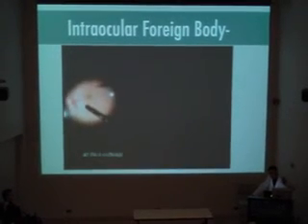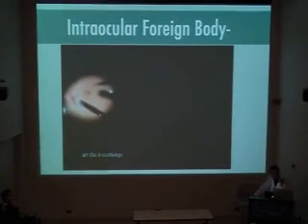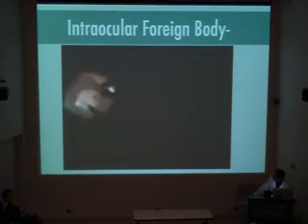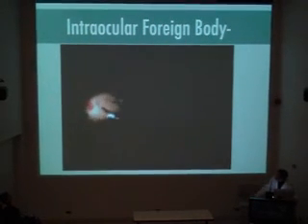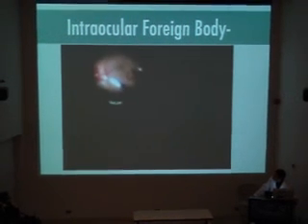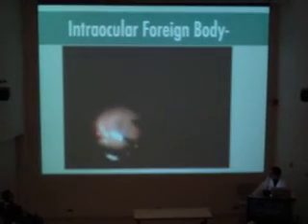Fluid from the cavity of the eye gets underneath the hole, and like wallpaper peeling off a wall, the retina lifts off, and it's a detached retina. Now the whole eye is being filled with an air bubble. It's called an air-fluid exchange. We basically suck out all the fluid and replace it with air.